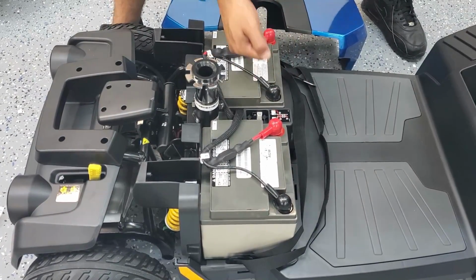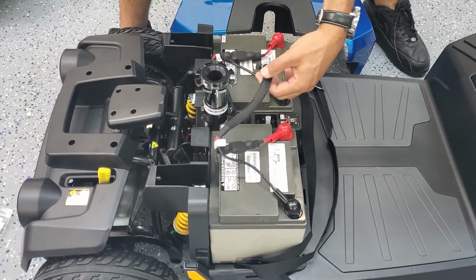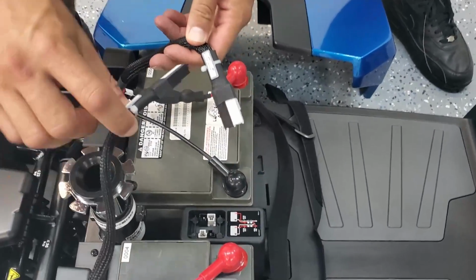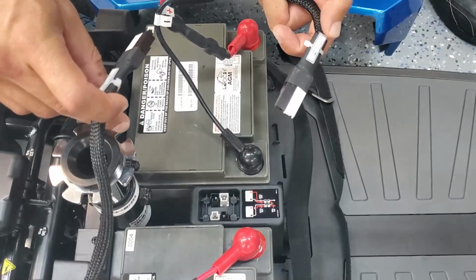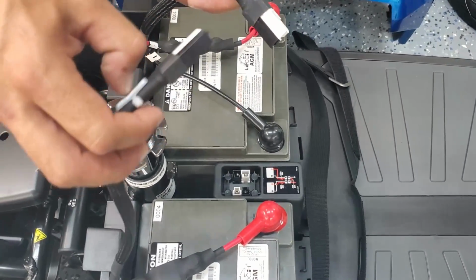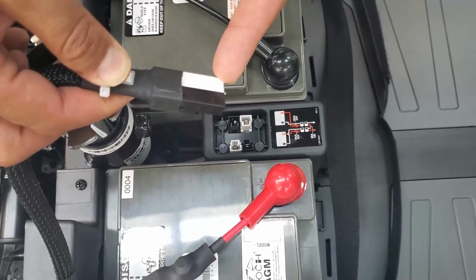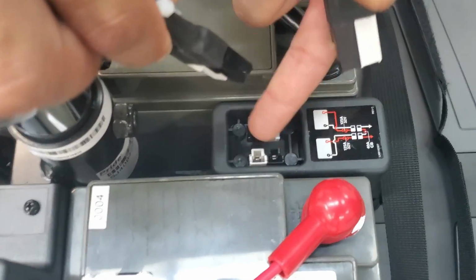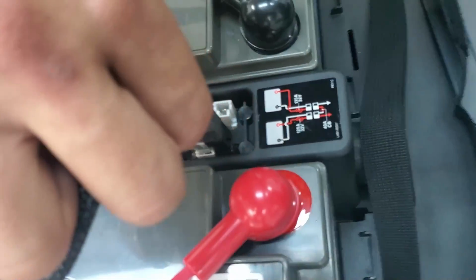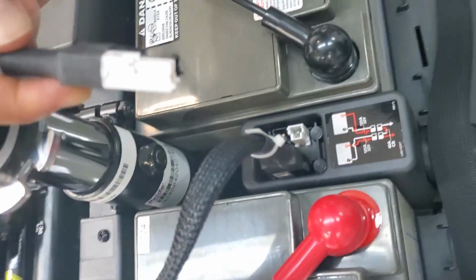There's no battery box to conveniently lift it up and take it out, but you are going to have to connect the batteries. So you take the cover off, and you're going to find these two loose cables, and they have basically two black and white connections. The one on the right goes to the receiving port on the right, so you want to line up the white with the black male end to the white and the black female end, and go ahead and make that connection so that the batteries can actually make contact with the scooter's control unit.